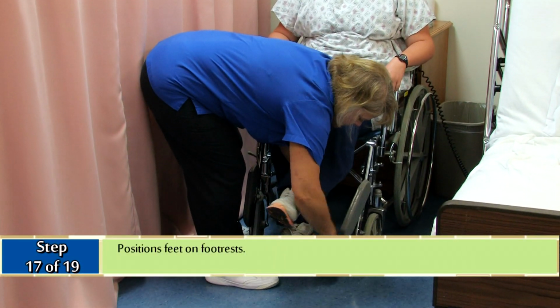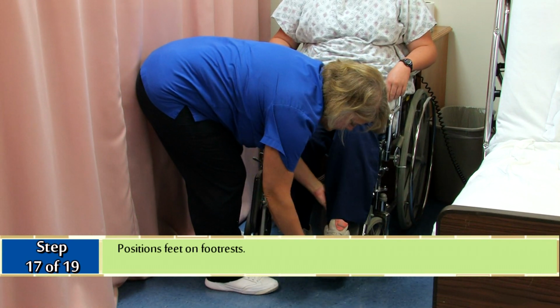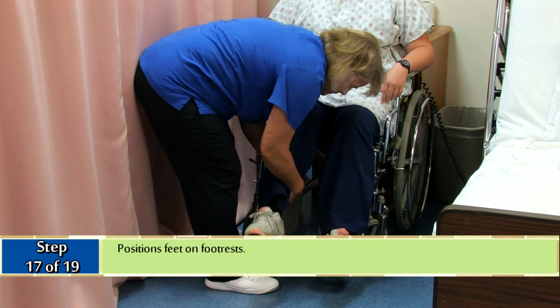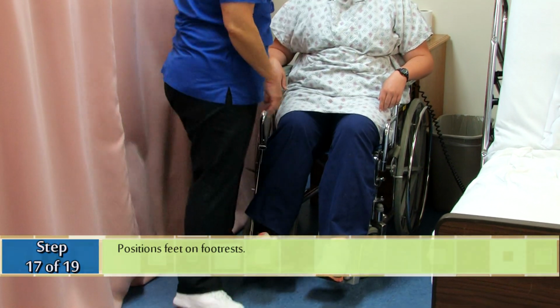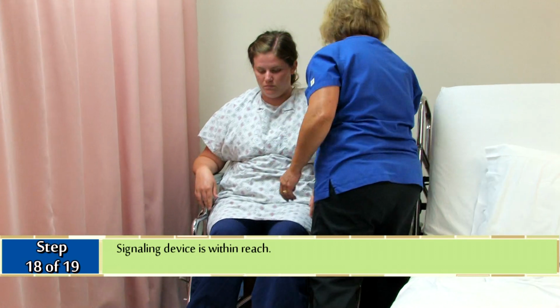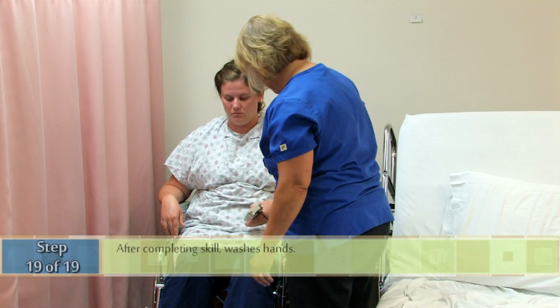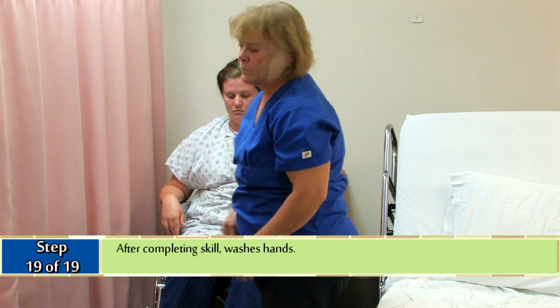Positions feet on the footrest. Signaling device is within reach. After completing the skill, wash his hands.